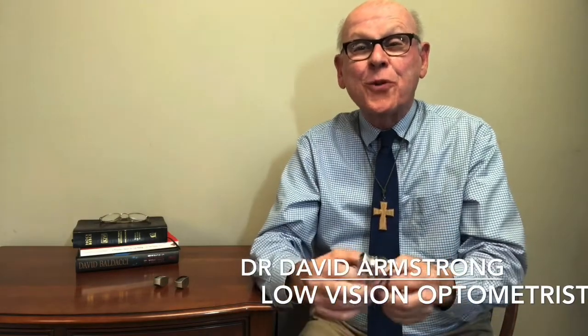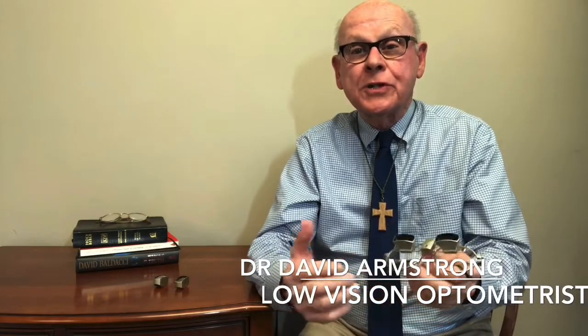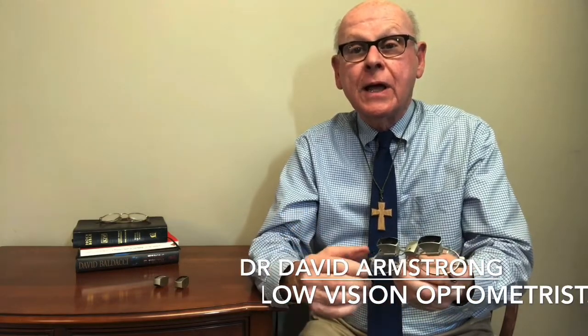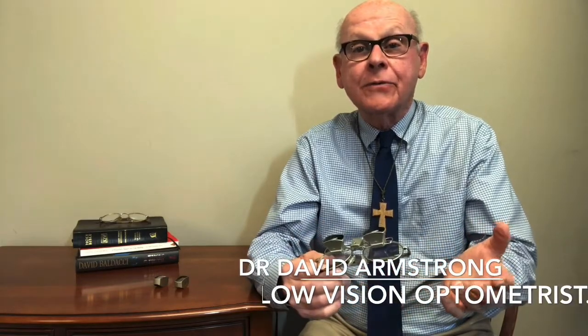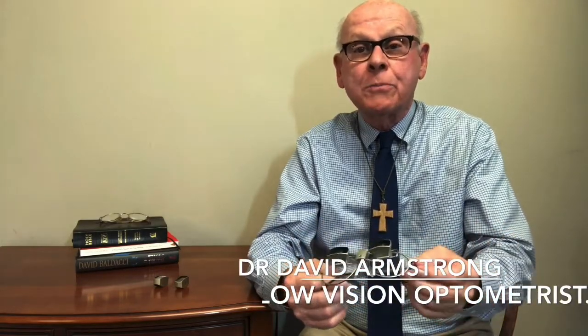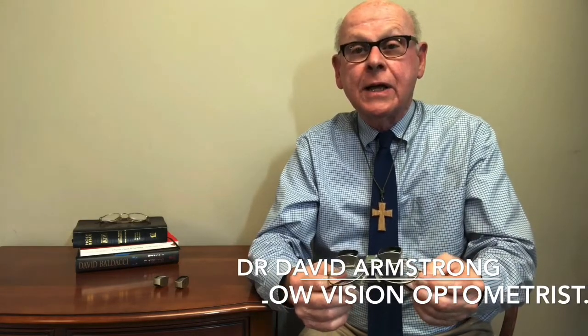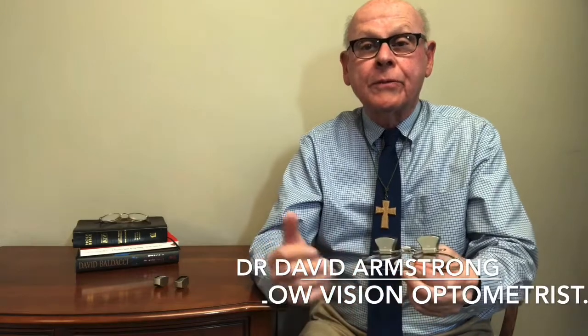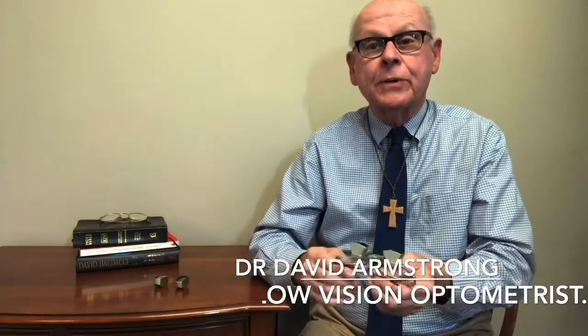So there are a lot of ways of helping people with low vision see better for reading, and that allows them to enjoy something that they have probably always enjoyed. It's important to them, and they miss it when they have low vision. And with one of these types of glasses, we're often able to get them back where they can read very well.